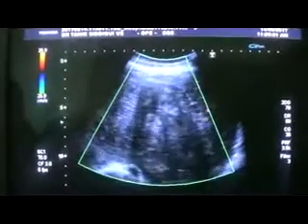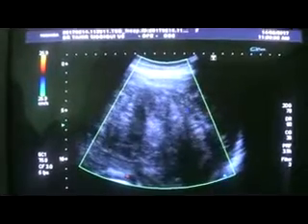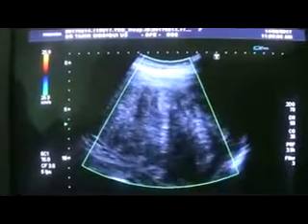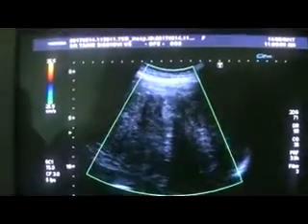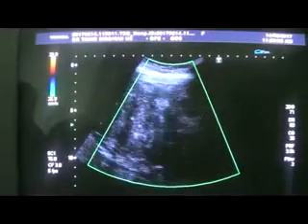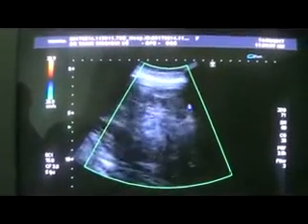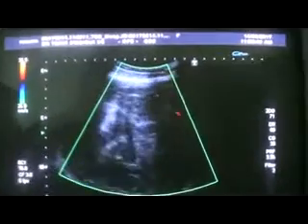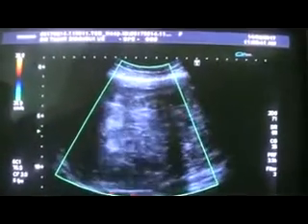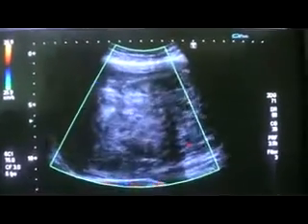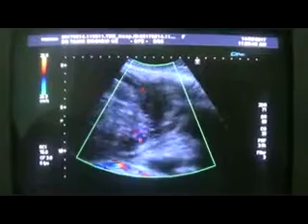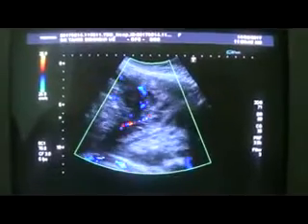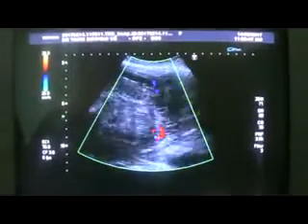It extends from the epigastric region. Now I am at the epigastric region, and from here I move the probe down in the center, longitudinally, and down into the periumbilical region.